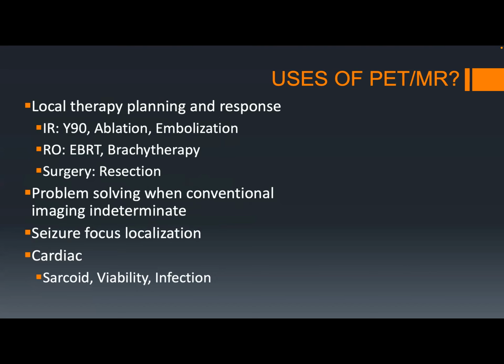So we're doing it for local therapy planning and response. Our interventional radiologists love it for Y90 for initial planning as well as for response assessment. Same thing for any other local therapy that's IR driven, so ablations or bland embolization even. The radiation oncologists are very interested for planning their EBRT and brachytherapy off of the pre-treatment scans as well as for response assessment.